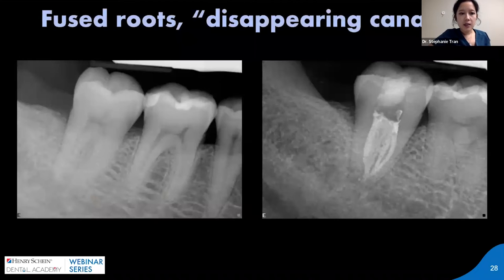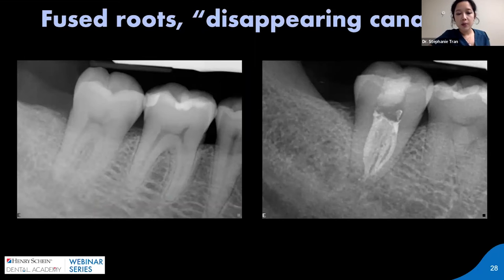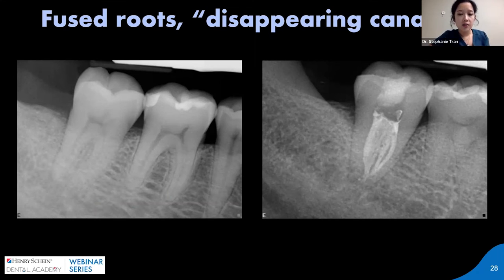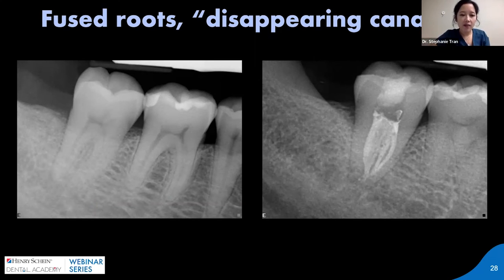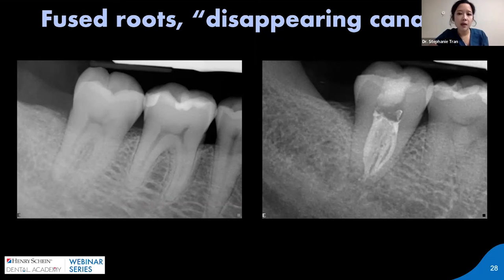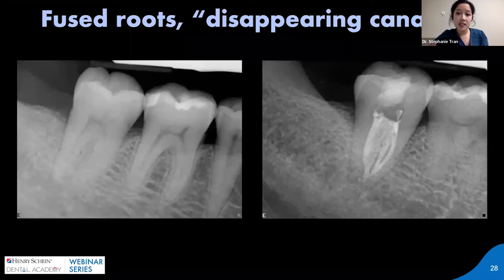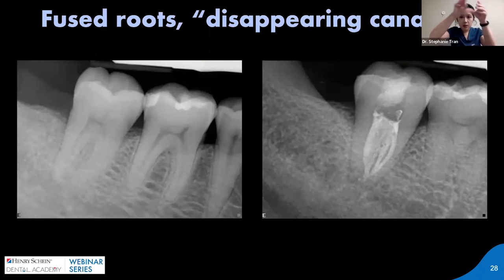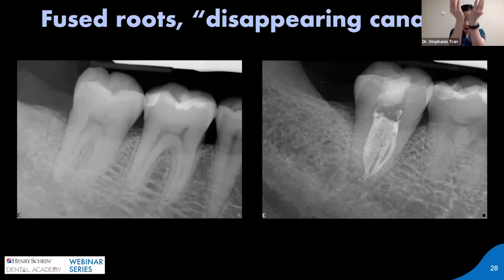We can see fused roots present in several ways. In this preoperative radiograph, we can see the coronal third of the canal system, but the canals all of a sudden sort of disappear in the apical half, and we can see the roots basically come together. That made me very suspicious of a C-shaped canal system. And in the post-operative radiograph, we can confirm it was indeed a very large C-shaped sheet of canal tissue, which is why it comes together like that.